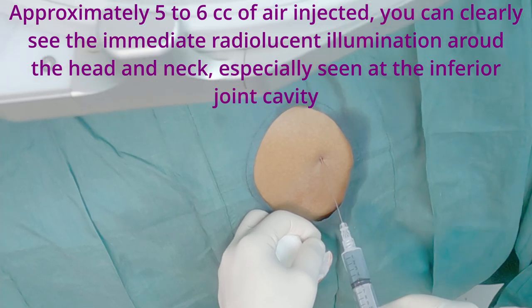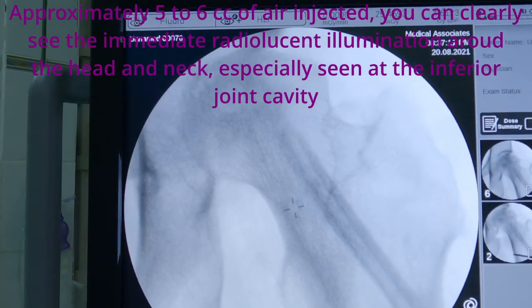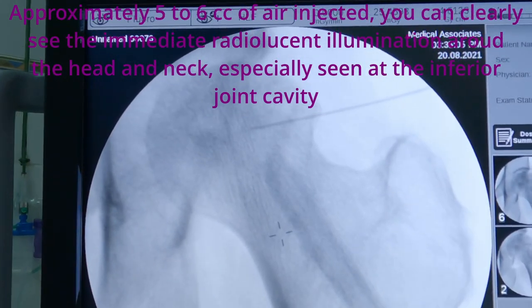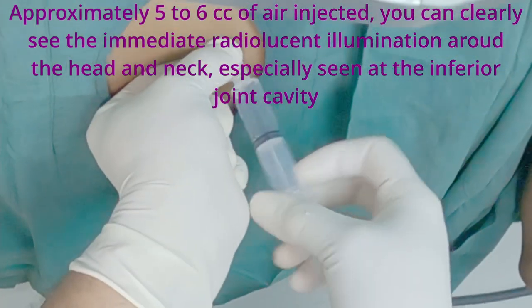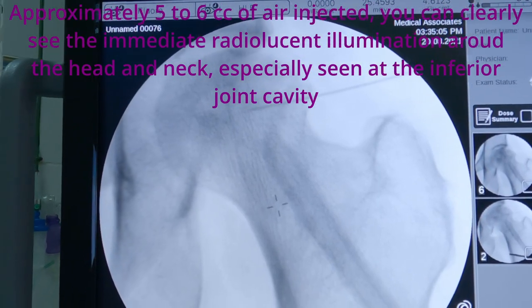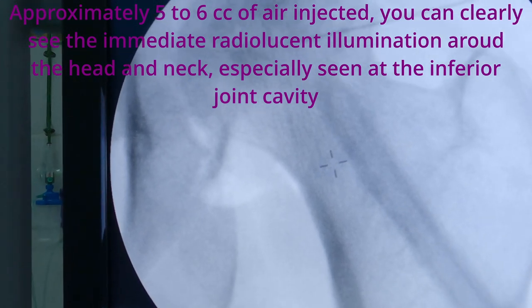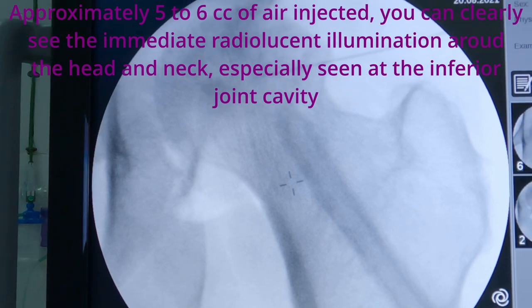Air arthrogram is performed by injecting approximately five to six cc's of air. You can clearly see the immediate radiolucent illumination around the head and neck, especially seen at the inferior joint cavity. You can clearly see the difference between the pre and post air arthrogram. This confirms the tip of the needle is inside the joint cavity.